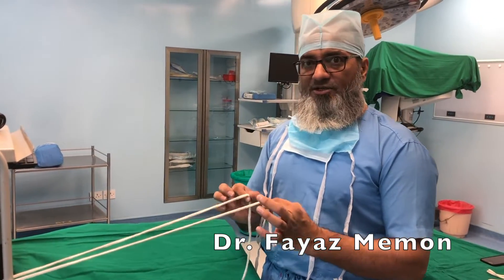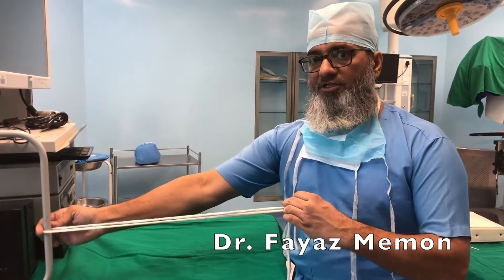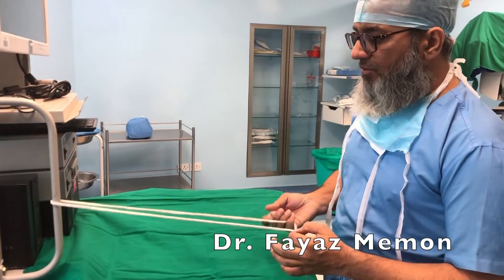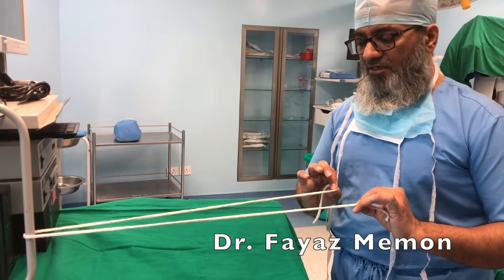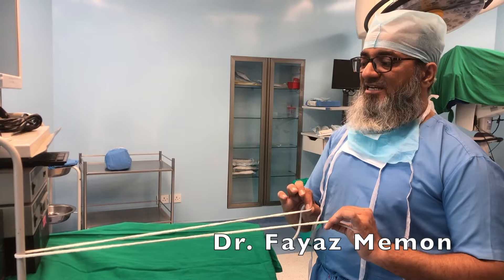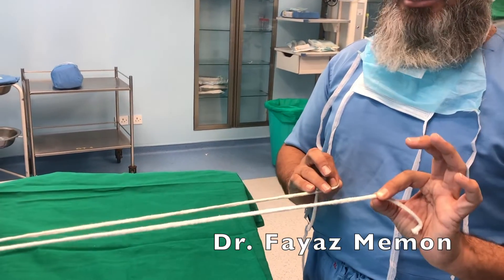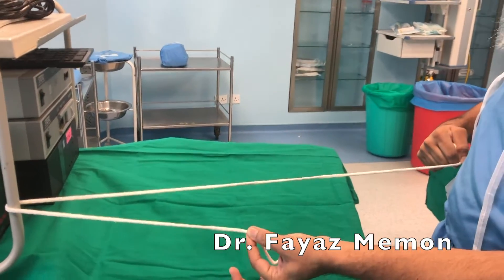First we are going to talk about the sliding knot. This is the suture which goes through the anchor over here — you can consider this as the anchor, and this is how the thread slides. Now these are the two limbs. While we take a knot we need to know on which side the knot has to go. The side on which the knot goes is the post.